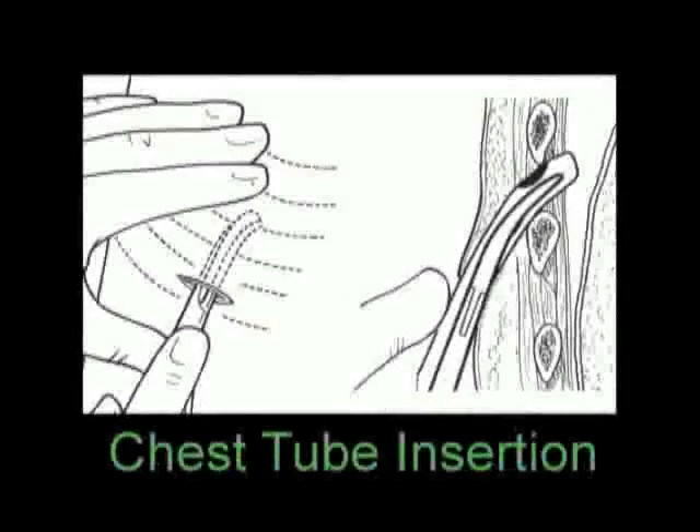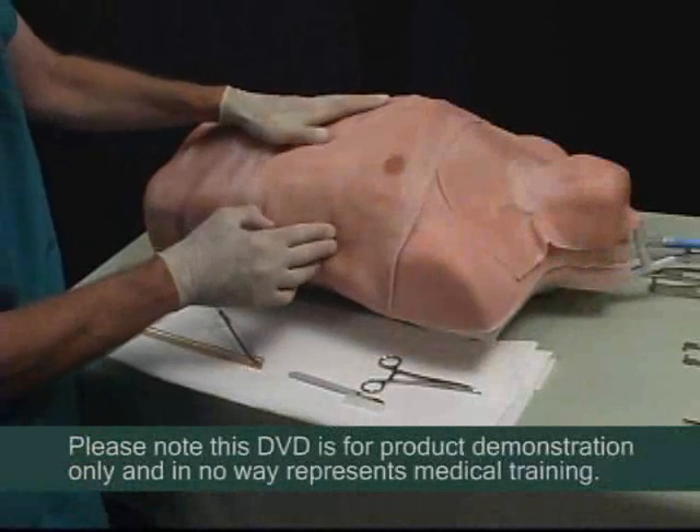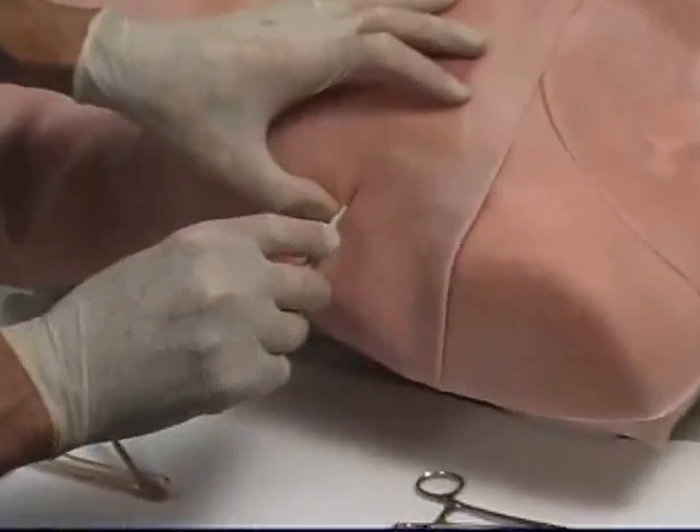The next procedure is the chest tube insertion. TraumaMan is designed to allow for the chest tube insertion into the fourth and fifth intercostal space on both sides of the torso, allowing four students to complete the procedure on each tissue.